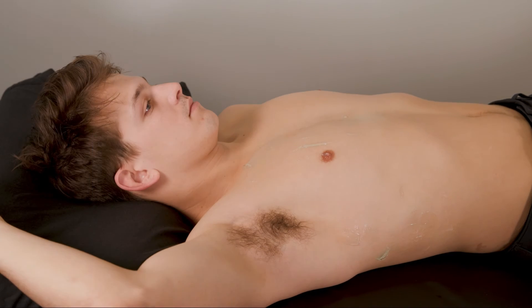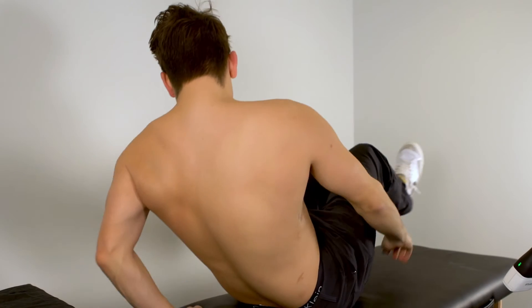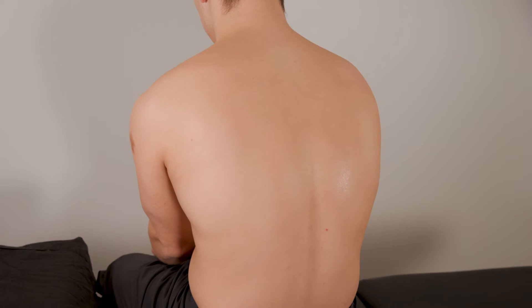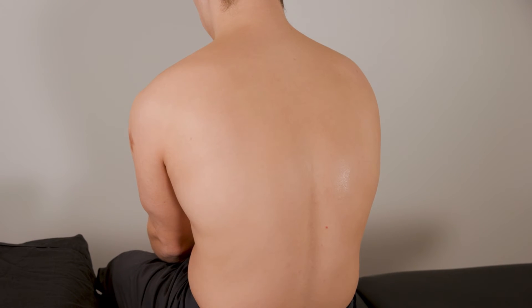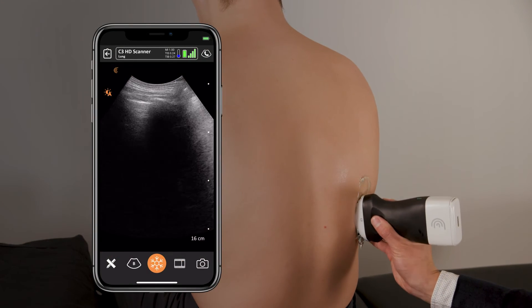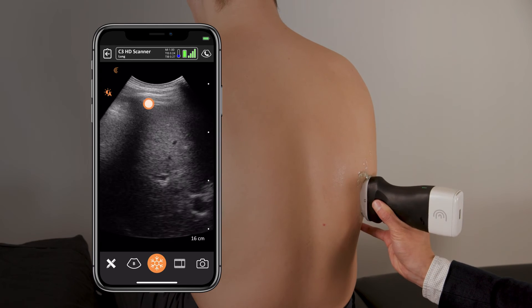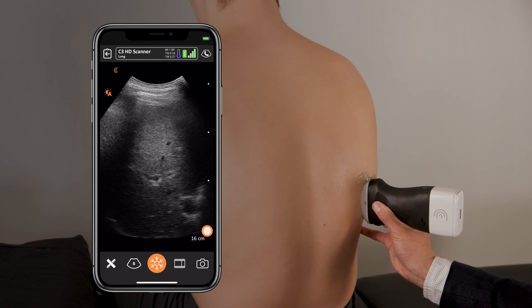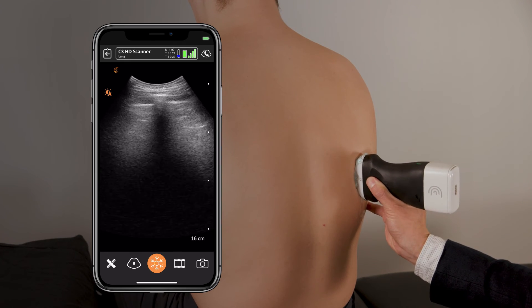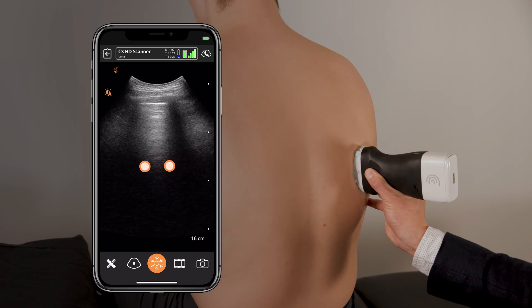To visualize the posterior chest, have the patient sit up. It's helpful to have the patient internally rotate both arms or shoulders to move the scapula laterally, exposing more of the upper lung. Start low and identify the liver so you know you are at the inferior lung edge. Then slide upwards and look for the typical landmarks of the ribs with the pleural line in between.